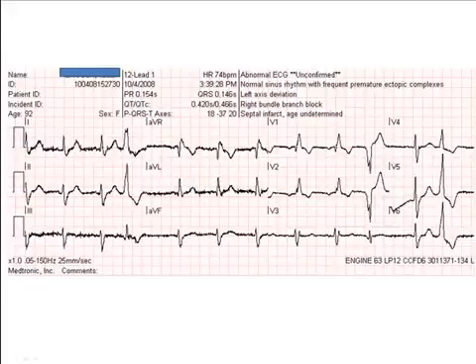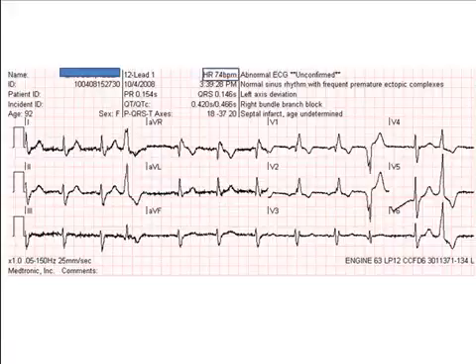Here's a 92-year-old female complaining of nausea. In our 3-lead assessment, we determined that the heart rate was not too fast or too slow. If so, we would have fixed it. Let's start with the confirmation that we are in diagnostic mode. Next, calibration. Remember our goals of therapy. We'd be between oxygenation and pain management. But before we do pain management, we need to look at the 12-lead a little further.